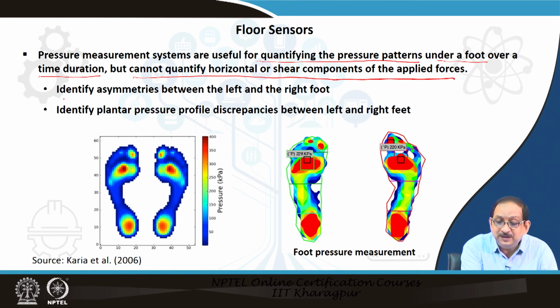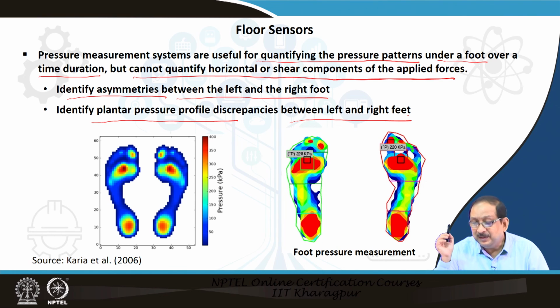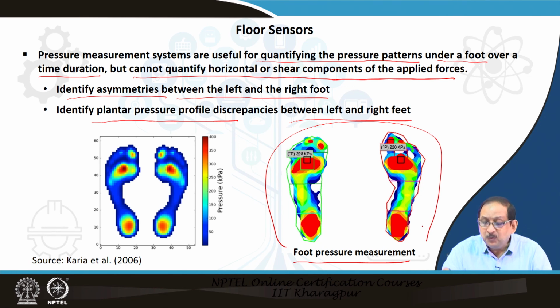It can be used to identify asymmetries between the left and the right foot, and it can help me to identify plantar pressure profile discrepancies between the left and the right foot. So it is a foot pressure measurement system which can give me important information on the pressure distributions in the left and right feet.